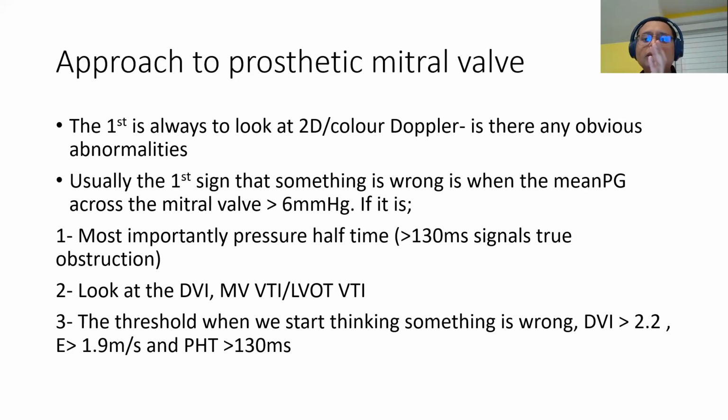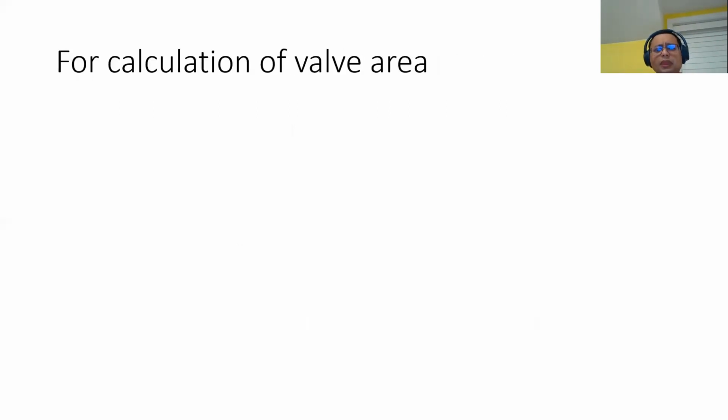There's also another one, which is an algorithm. This is called the Blauwet Miller algorithm that I will show you a little bit later. This algorithm is a little bit more familiar because we just look at the algorithm and try to see what is the type of dysfunction.